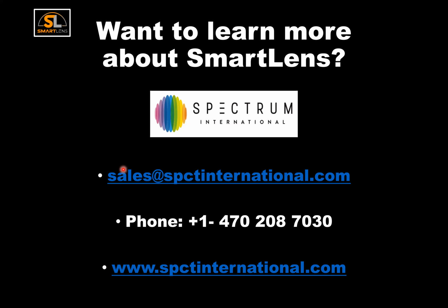Of course, if we have an add that's distributed over 3 millimeters, but we have an incredibly small miotic pupil that is only 2 millimeters, we need to know the size of that pupil to appropriately distribute the power. So if it's possible to measure pupil size with your corneal topographer, as an example, that may be the best way to help us build that initial multifocal lens.